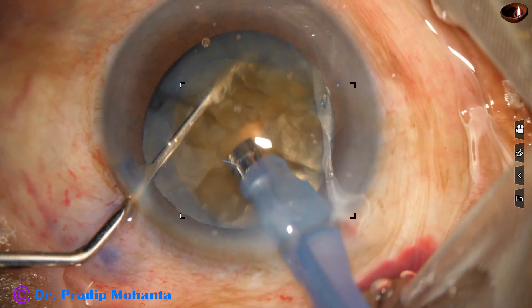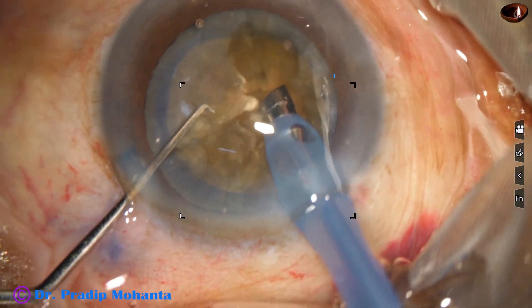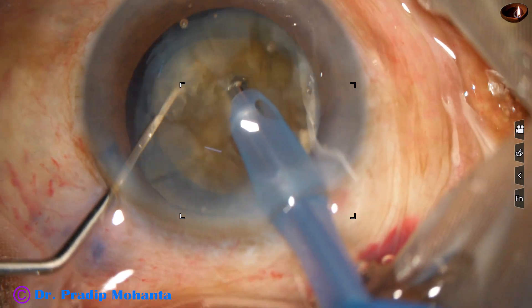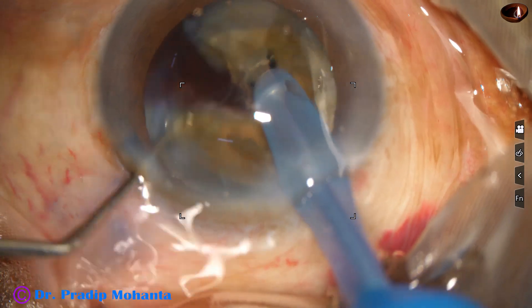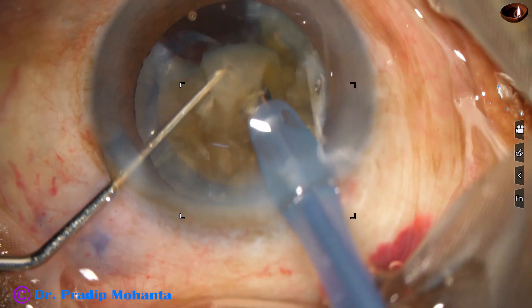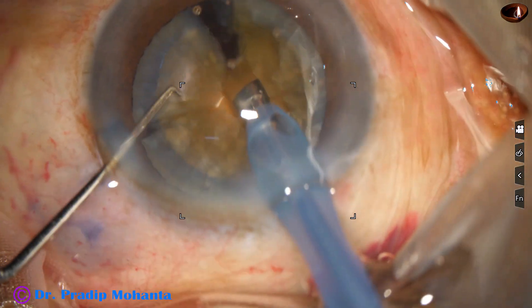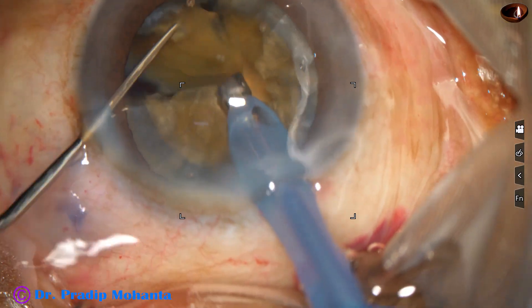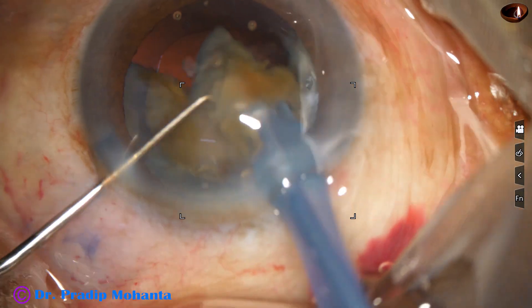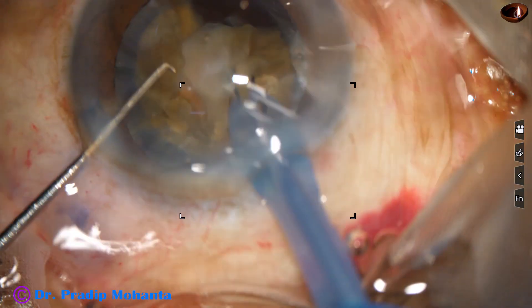Whenever I get a free fragment, I am going to remove that fragment. All the fragments are joined to each other at the center, and whenever I get a free fragment I use ultrasonic energy to emulsify it. Ultrasonic energy used in this case is 85%, flow rate is 45 ml per minute, and vacuum is 450 mmHg.